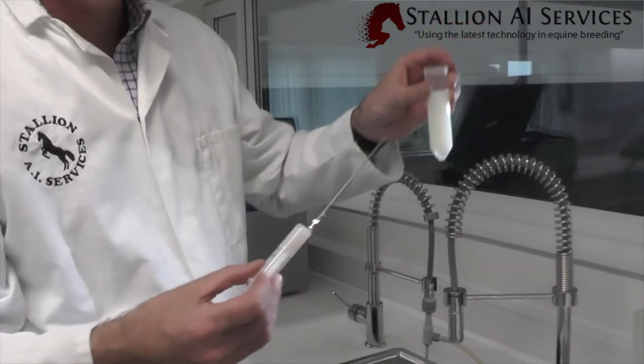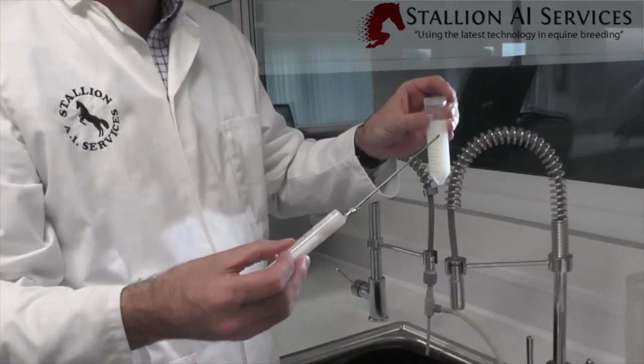That's the idea of the cushion — the semen sits on top of it, and we simply take the semen off the top of the cushion.